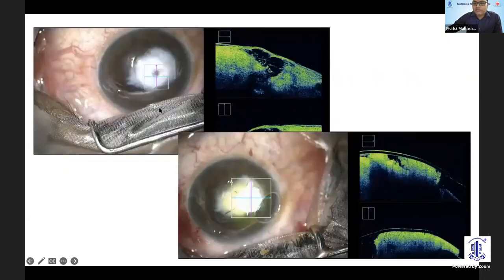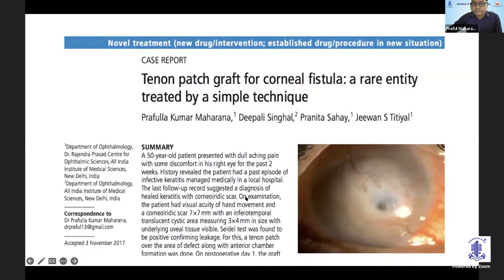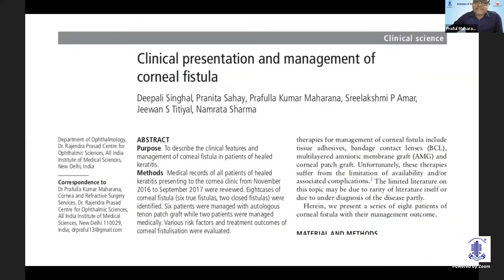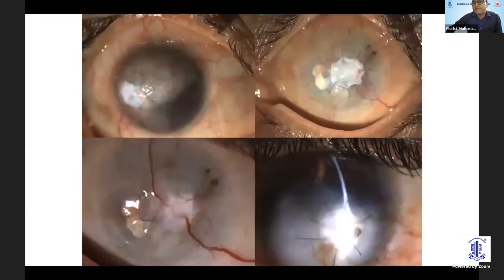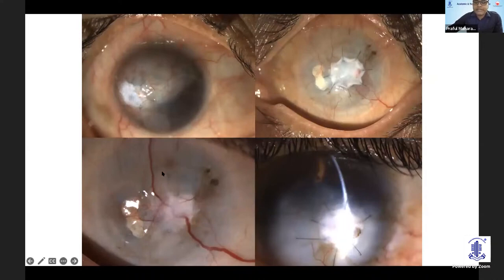This picture shows a free communication, and the tenon's patch is well covering that fistulous tract. We published a series of six cases in BGO. Subsequently, Dr. Namta came out with a paper including 31 cases of tenon's patch graft. The outcome is usually good, but there are a few problems — there are some superficial vessels that come up, possibly due to intense inflammation postoperatively.